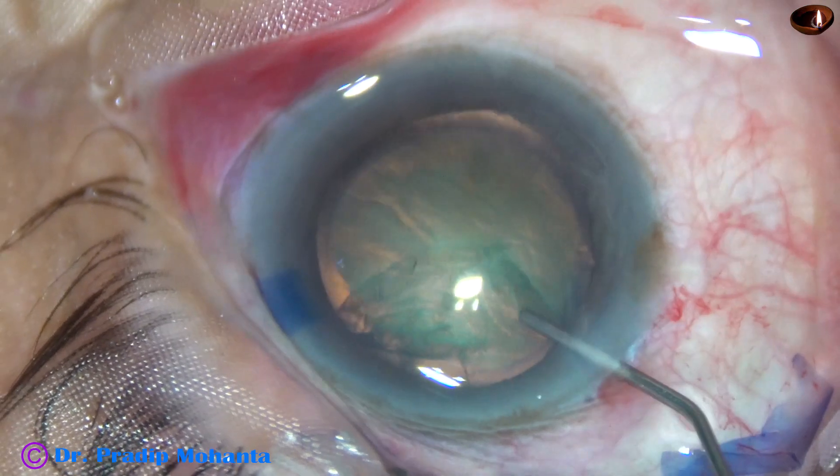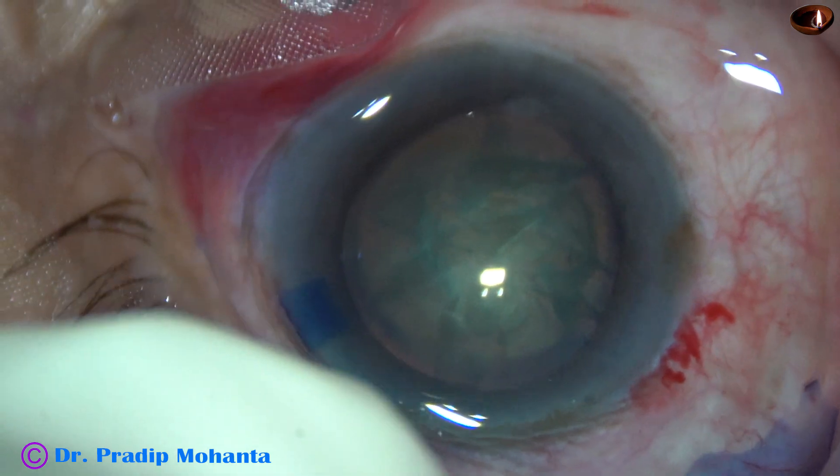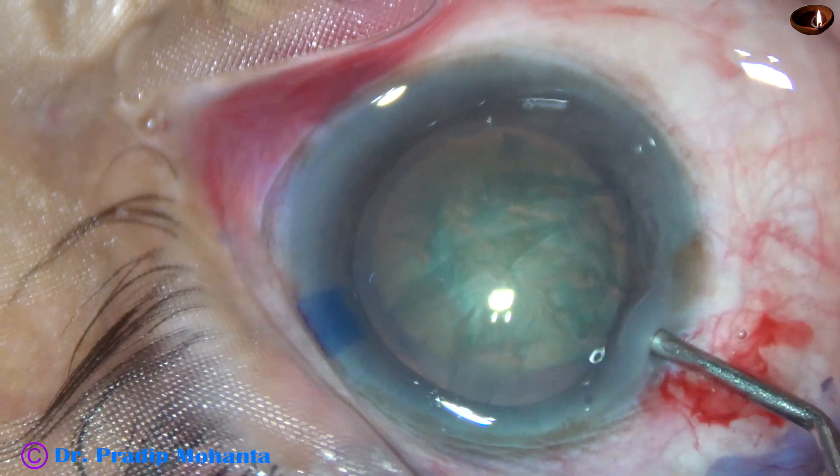This is rotation of the nucleus. And now some more OVD is injected into the anterior chamber.